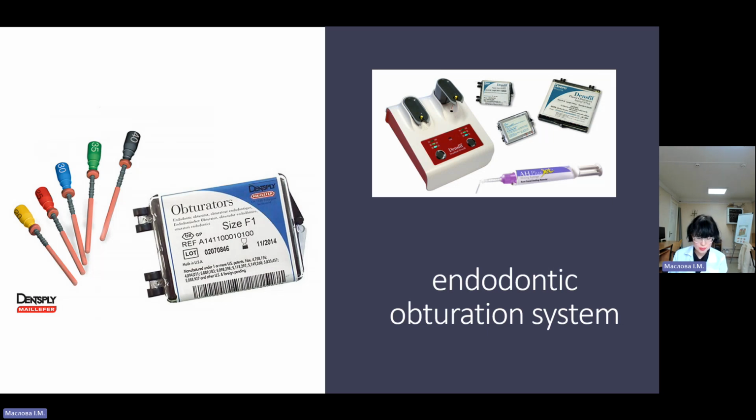Chlorhexidine impregnated gutta-percha points. It is the next variant of gutta-percha points. Some studies have shown that Enterococcus is relatively resistant to calcium hydroxide. In order to take advantage of the antimicrobial properties of chlorhexidine, especially against Enterococcus, chlorhexidine impregnated gutta-percha points, Active Points, have been marketed.